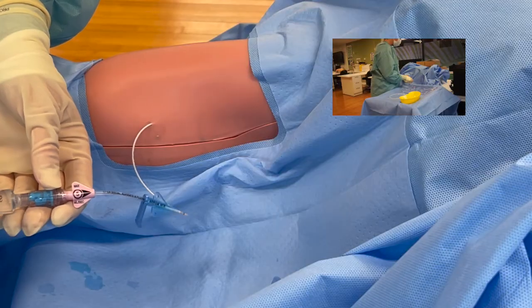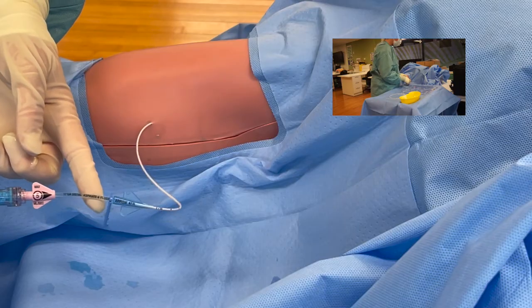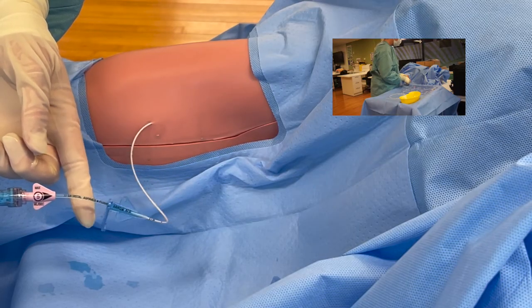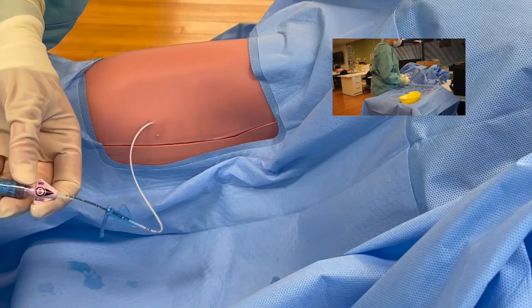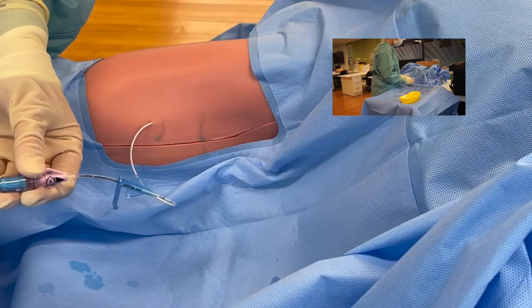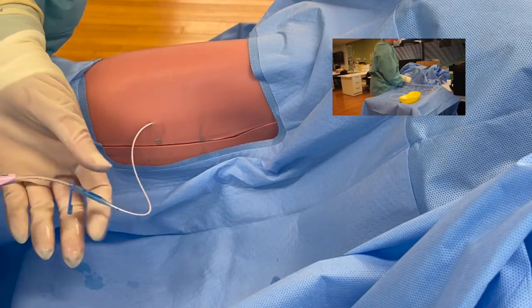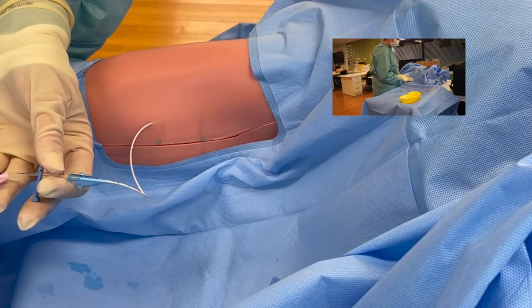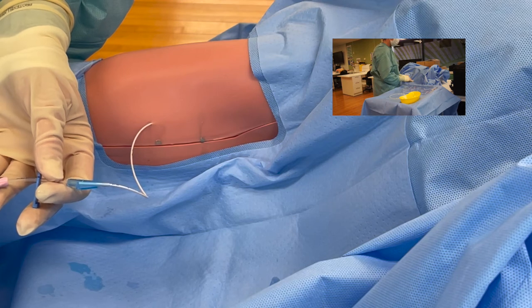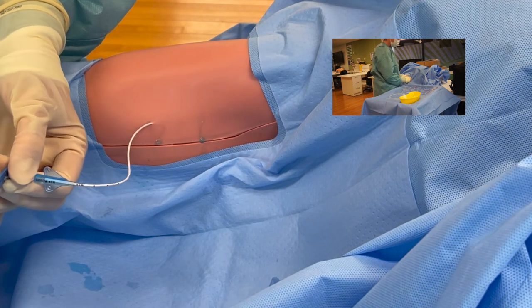Once you've attached your syringe, you will aspirate blood into the clear portion - that's venous blood into the clear portion of the PICC line. Then force push, pause, remembering not to empty your syringe as your flush. If your PICC line does have a clamp, disengage the syringe, let the positive pressure device do its thing, and then clamp the line.